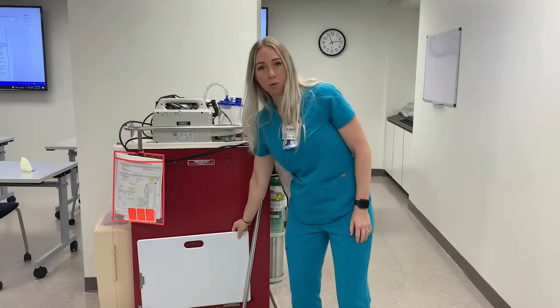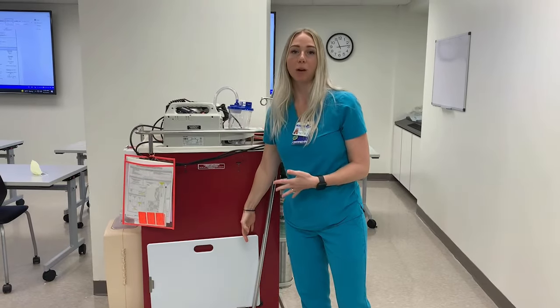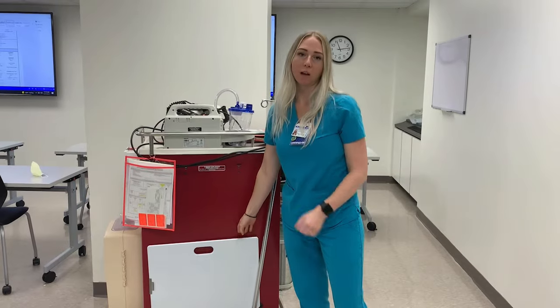Finally we have a backboard on the back of the crash cart. As you know, as soon as you enter the patient's room we need to be placing that backboard underneath the patient to be able to provide high quality CPR.